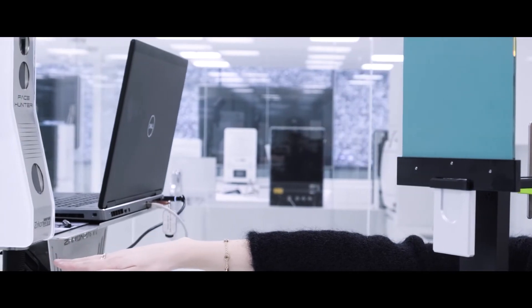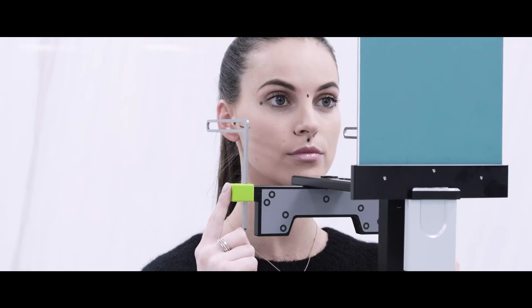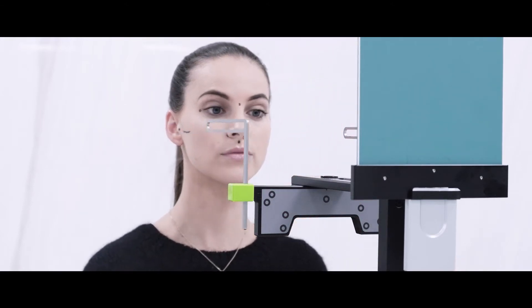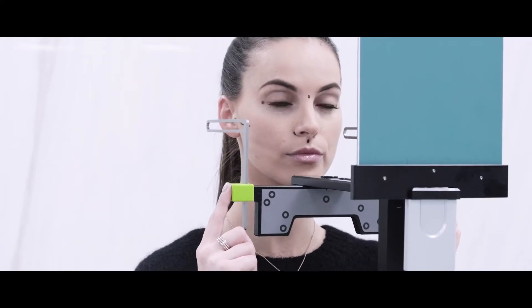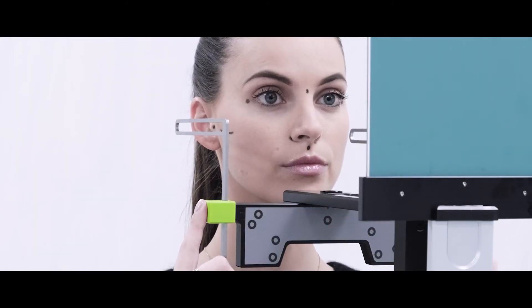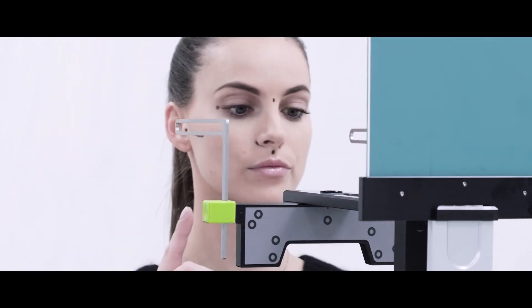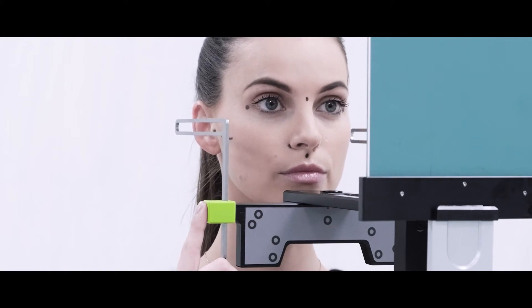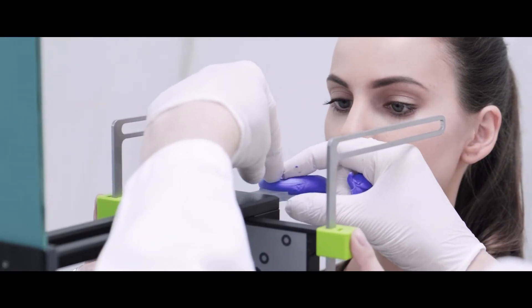The patient positions herself at a distance of about 70 centimeters from the FaceHunter and looks into her eyes in the mirror. In this way, she will spontaneously adopt her natural position. At this point, the dentist proceeds with the scans. Between the scans, the patient moves away from the plane finder and gets back in front of it. This operation is repeated for a minimum of three times. It is very important that the patient puts her fingers on the side buttons of the plane finder in order to find balance easily and avoid movements that could compromise the scan results.